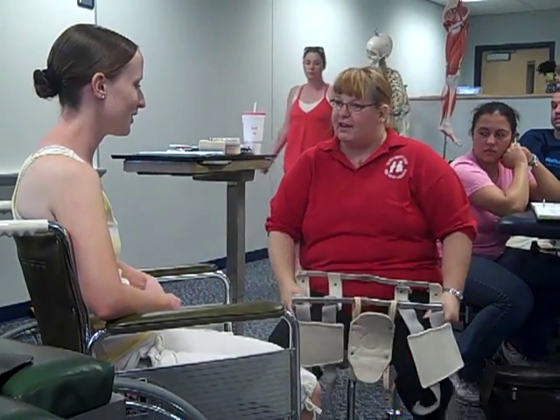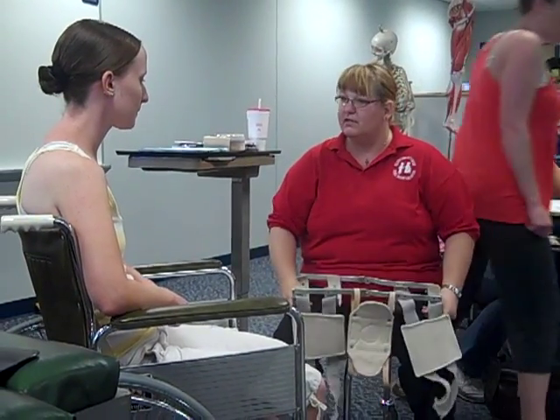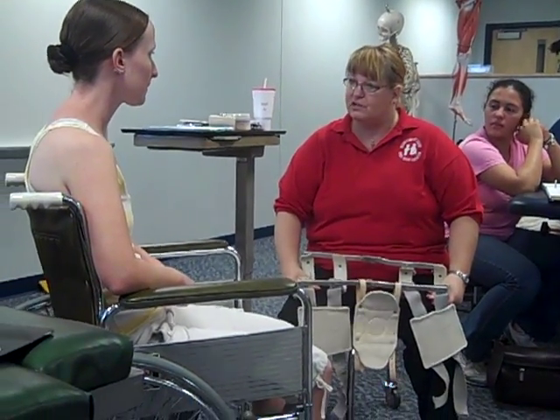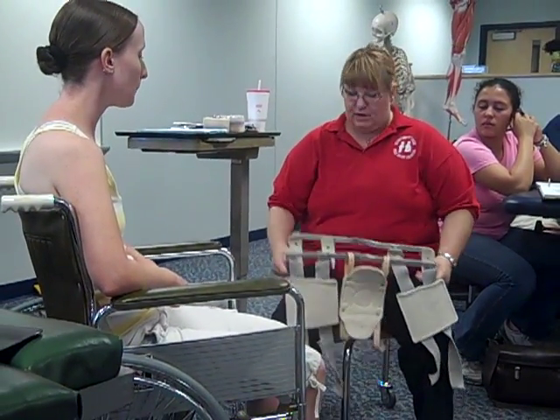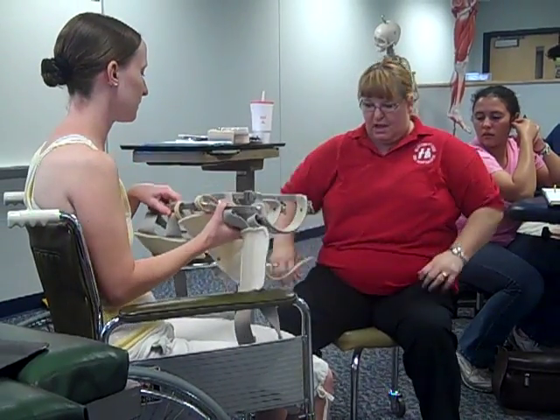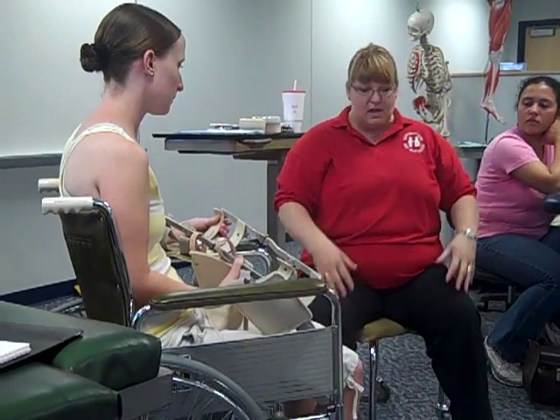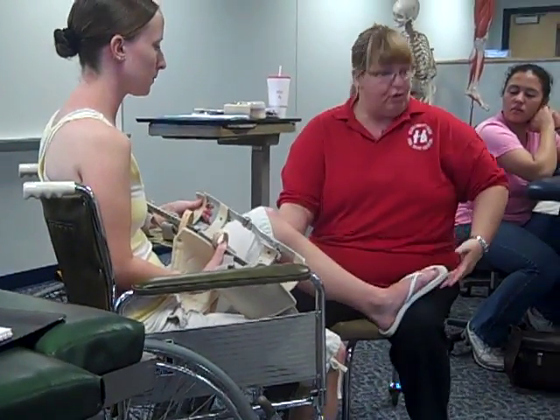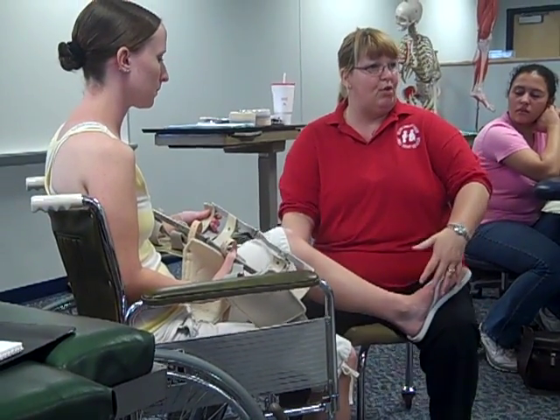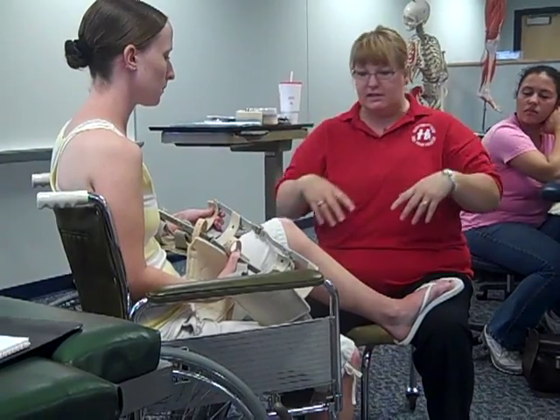Greeting the patient: 'Hi, my name is BJ. I'm from physical therapy, and your brace came in, so we're going to get it fit to you today, make sure it's comfortable, and then we'll get you up and do some walking.' The patient may or may not be paralyzed — it could be a different diagnosis — but just to be safe, I'll help with the leg. If I put her foot on my knee, I can control whether she's straight or bent, and it frees up my hand.